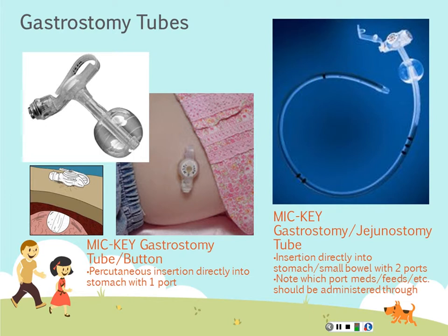Generally, we see gastrostomy tubes used for long-term enteral feeds or when esophageal atresia or stricture is present, so they wouldn't be able to place a nasally inserted enteral tube. And then jejunostomy tubes are long-term internal feeding tubes as well, indicated when gastric feeding isn't tolerated.